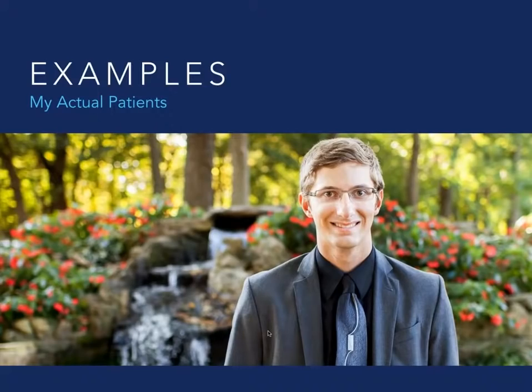So what I tell patients, and a good way to do this with Invisalign, or with any clear aligner therapy, by the way, I know I've said Invisalign, I'm an Invisalign provider, I can't get away from it, but there's obviously other options out there. But with any clear aligner therapy, I recommend that you tell the patient to really get a sense of how the trays fit, and tell them that, hey, we give you a guideline on when to change the tray, but you're an adult, and you're responsible for the result here. So really make certain that you gauge that.